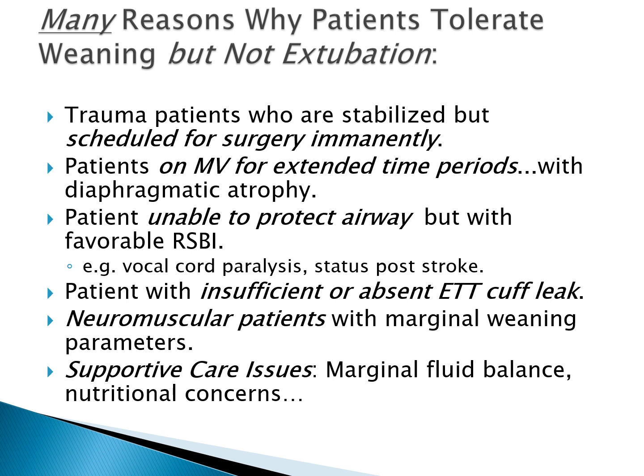Patients with insufficient or absent endotracheal cuff leak. The exception there is sometimes for patients who are intubated for 10, 12, 13 days, gelatinous secretions can form around the cuff. So sometimes when you deflate it, you don't really form a cuff leak. So you just need to be aware that sometimes you can get, if you will, a false negative, where the patient doesn't have a swollen airway. It's really a secretion issue. That's where your use of subglottic endotracheal tubes can be very, very useful.